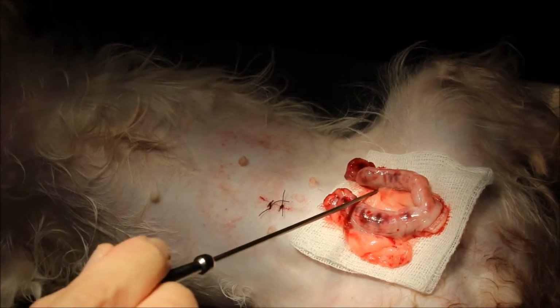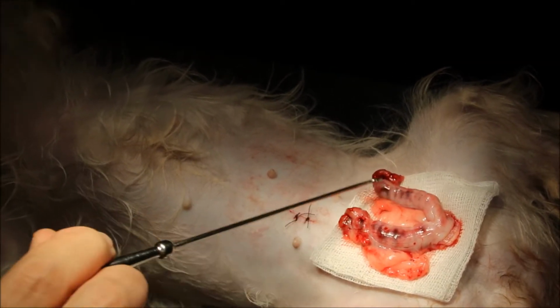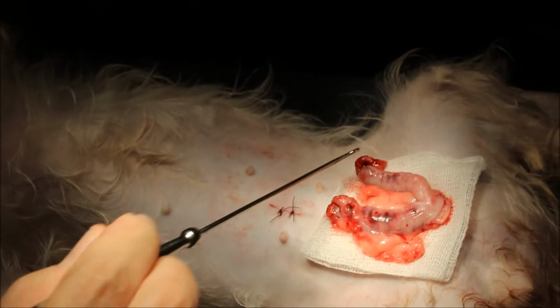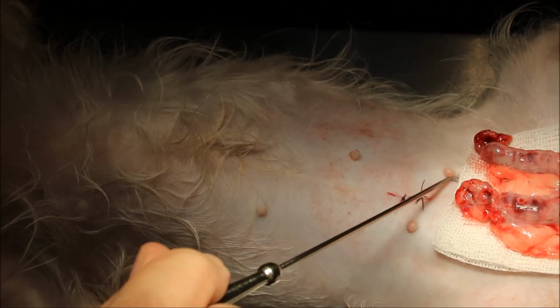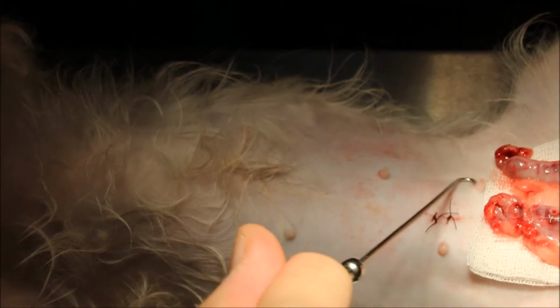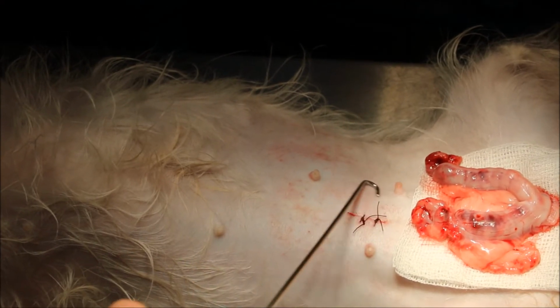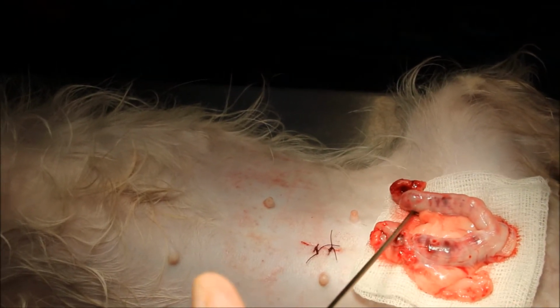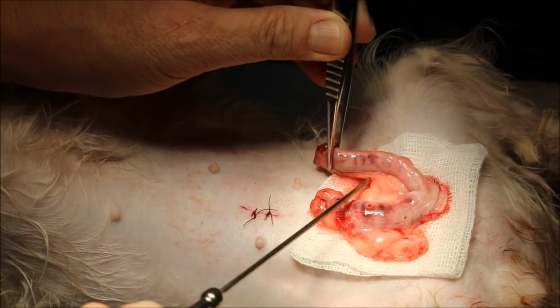So this is where many young vets cry, because sometimes they try and hook, but they can't get it. So they hook 10 times, 20 times, they can't get it, because sometimes the dog is too fat. Sometimes they can't manage to get the right location. The location is more or less 45 degrees to the skin incision, and then you turn your hook around and then pull. So if you don't turn, obviously you cannot. So you go in below the uterine horn, and then you hook up.